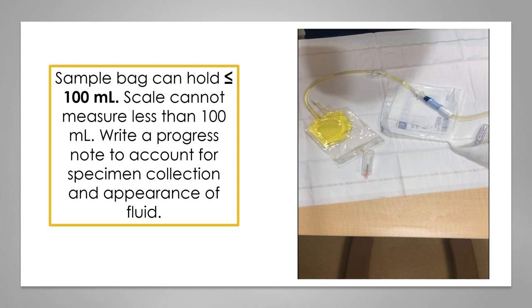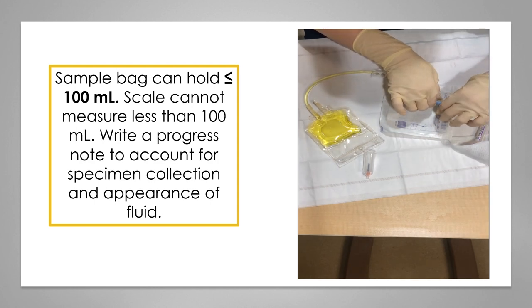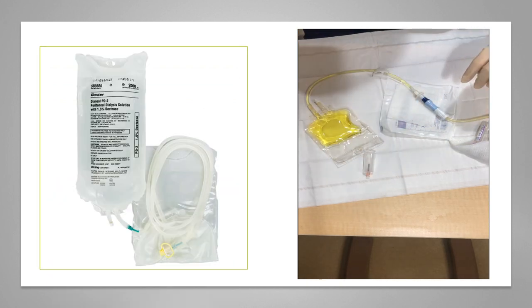To document this process, write a progress note stating less than or equal to 100 mLs removed for specimen collection, and describe the appearance of the fluid. You can replace the Baxter MiniCap with a new one, or you can connect the patient to the Ultra bag and continue to drain.